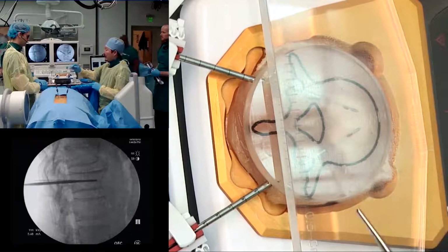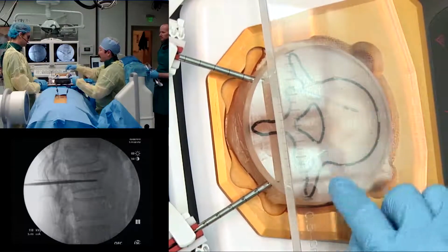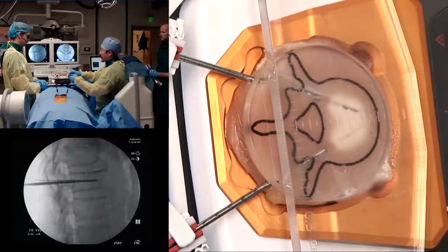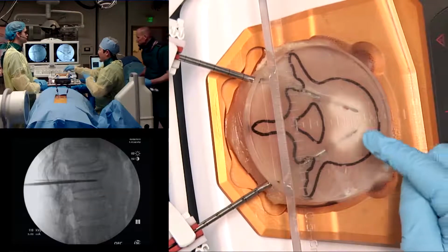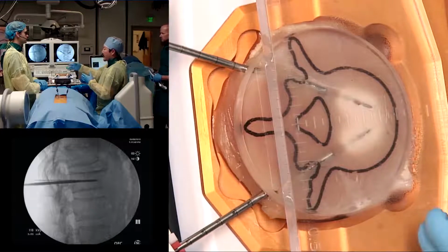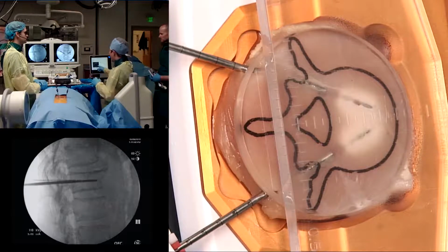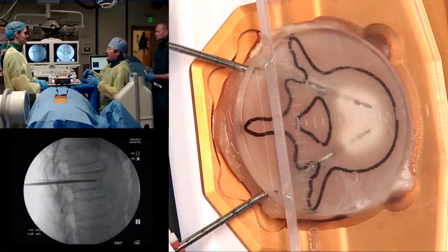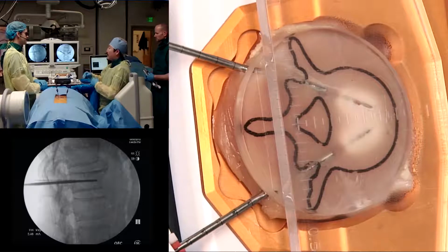And so what this is demonstrating is that, let's just say, we had the trochar in already. So what we do right before the balloon step is that we would introduce this RF probe. And over time, it varies depending on the size of the vertebral body. In the lumbar spine, because the vertebral bodies are larger, we would go on average maybe about 15 minutes. And in the thoracic spine, anywhere from like 6 maybe to 15 minutes, depending on the size of the vertebral body.